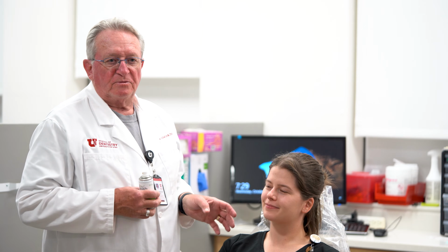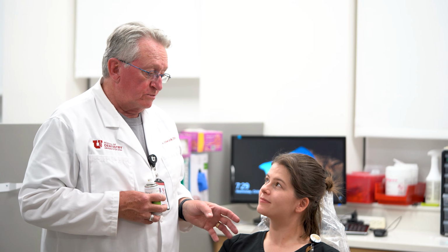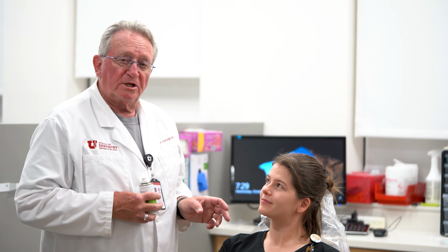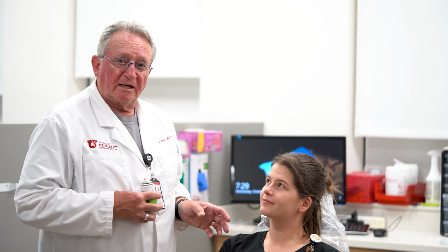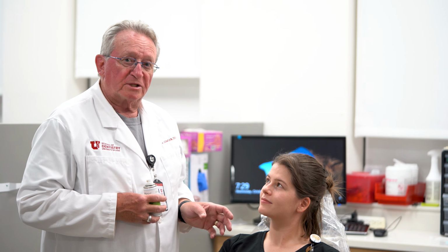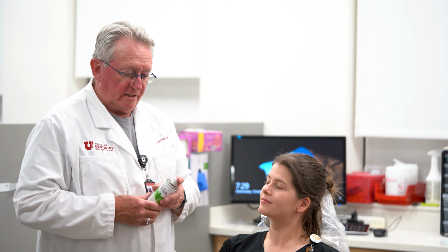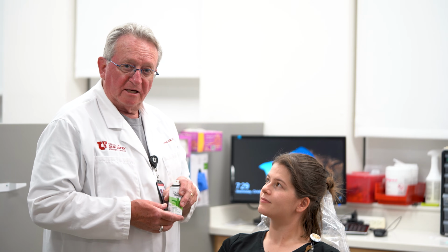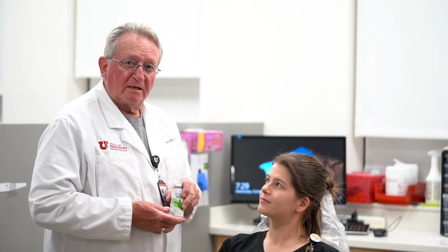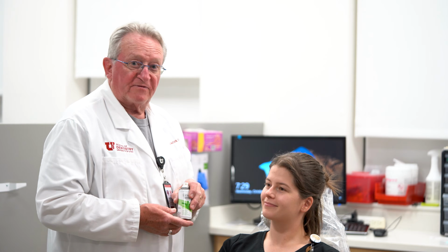In dealing with muscle tension type headaches, or even jaw and muscle pain, I usually always start on the trapezius and posterior cervical area, and I will do both sides. Even though one side is the painful one, I still want to do both sides to have balanced function on the muscles. I'll also often ask the patient, at what level is your pain, with 0 being no pain and 10 being severe pain. The other day when we worked with him, it was at a 4.